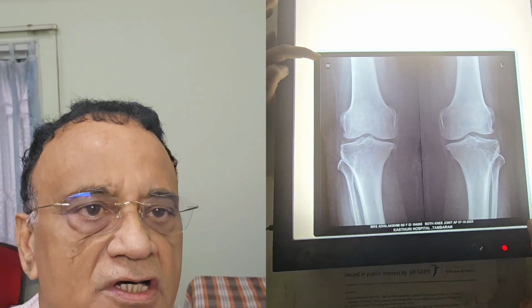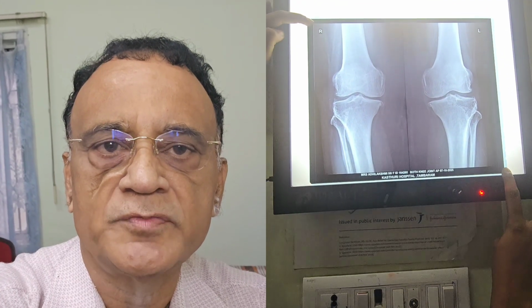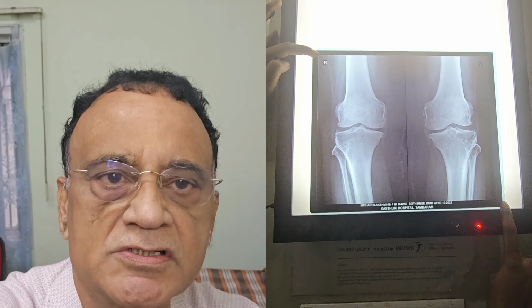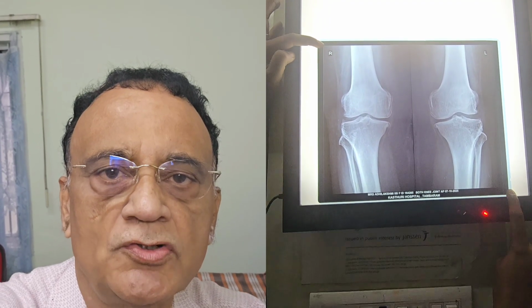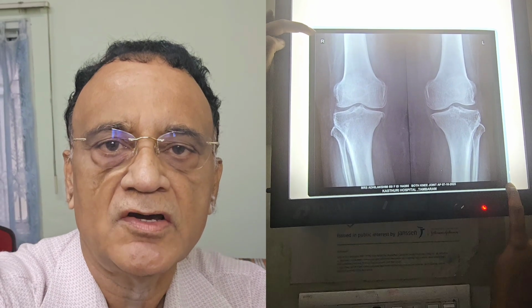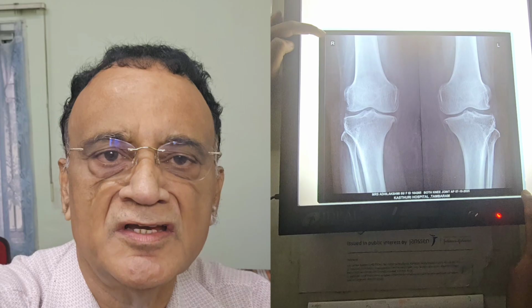We have just seen the patient's testimonial and these are the X-rays. Normally when a patient comes to my clinic, I get an X-ray done. This is the standard practice with orthopedic surgeons. If I want to proceed to further biological treatments, then I order 3 Tesla MRI scans. This is a standard practice.